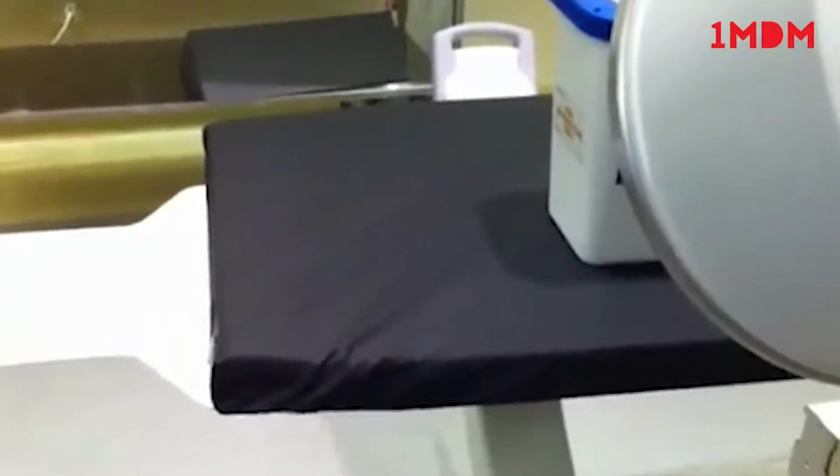I lock this one back so it won't move. When you start to swing here, sometimes you're not positive if this is going to strike the table or not. Something you don't really want to do, especially in the middle of a surgery, is hit the table that the patient's on. So let me bring it back to position. I take this lock off.